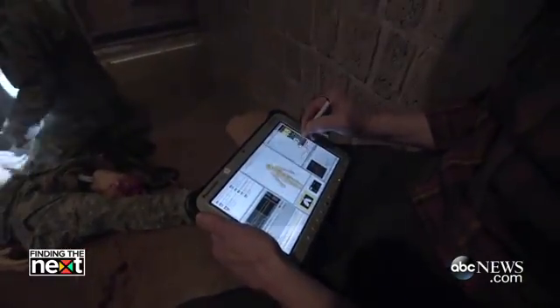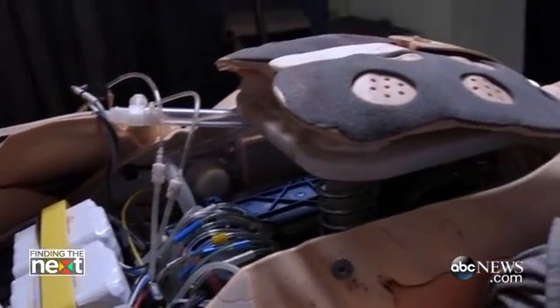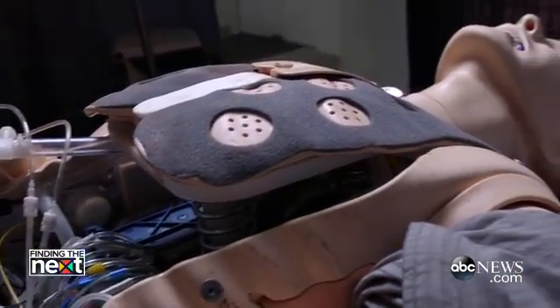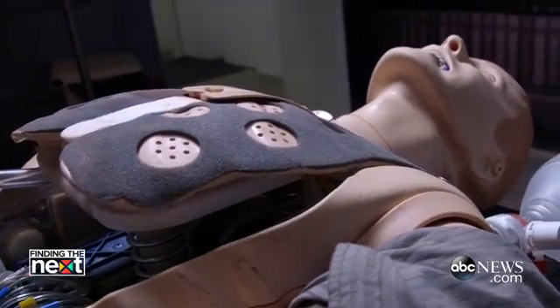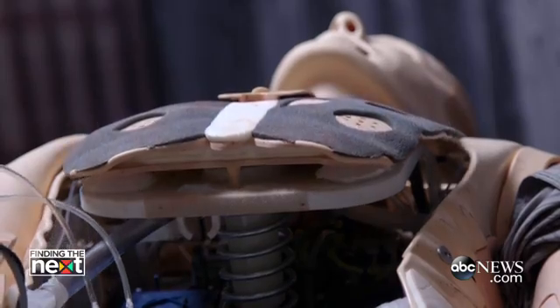Each mannequin comes with an instructor's tablet where we control anything from the vital signs of the patient. We can decrease the rise and fall on either side of the chest — left or right — to simulate the development of a tension pneumothorax, a collapsed lung. The student has the benefit of visualizing that rise and fall of the chest and being able to count the respirations, as opposed to an evaluator simply saying your patient is breathing 20 times per minute.